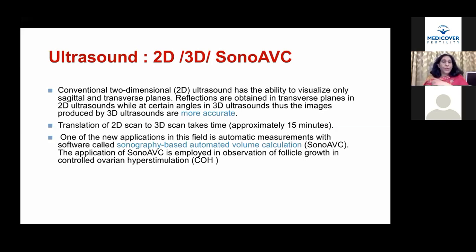One of the new modalities in this sphere is called sonography-based automated volume calculation. Now, sono-AVC is employed in observation of follicle growth in controlled ovarian hyperstimulation.